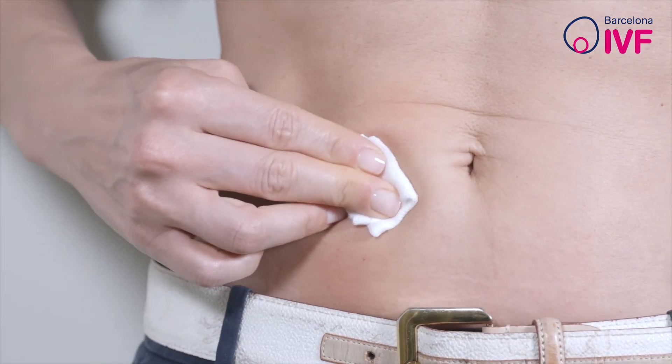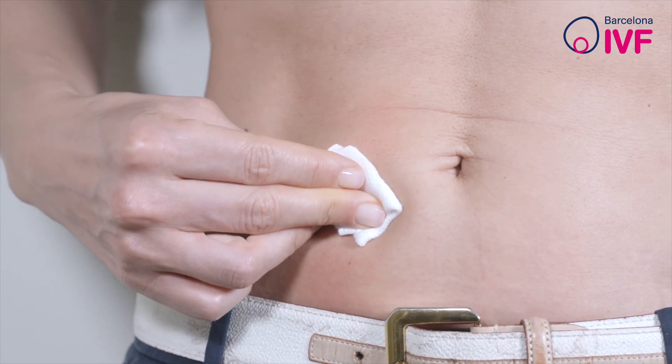Push the plunger located on the side of the pen all the way in, then gently withdraw the needle and put pressure on the injection site for a few seconds.